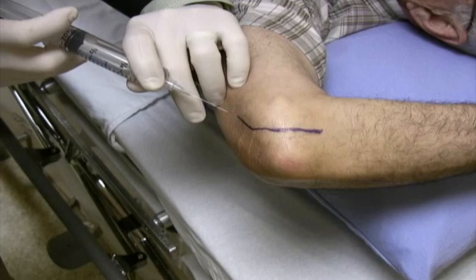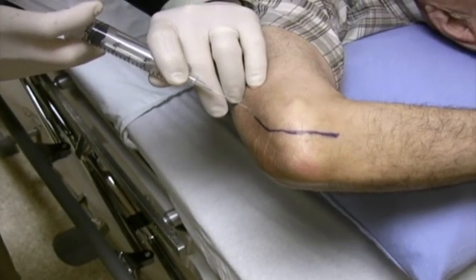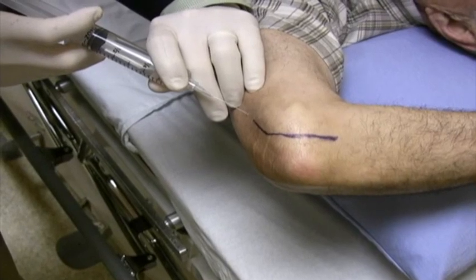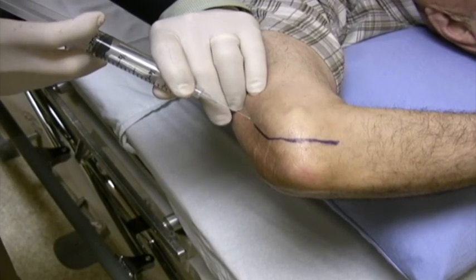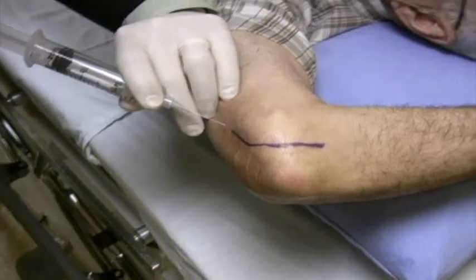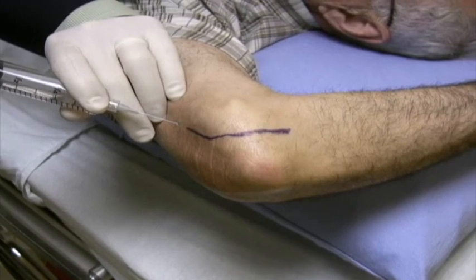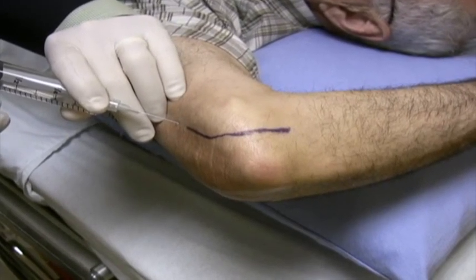So what we're going to do here, I'm going to go the most proximal place that I'm likely to go, which is right there. So don't move, don't move, don't move. Ouch, sorry for the sting. Once again, blow just a little bit underneath the dermis, and then pause. Let the local anesthesia work so that it doesn't hurt when I move the needle around.